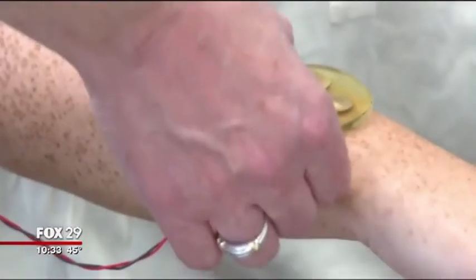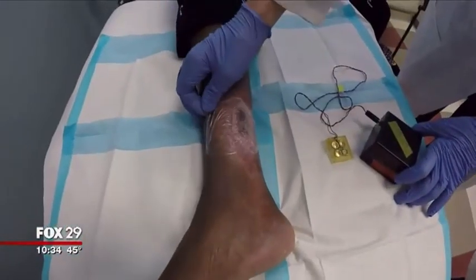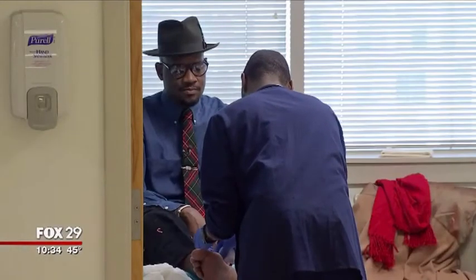"With the funding now, we are going to build a better device than we did in the pilot study. The ultimate goal is to actually build this into a compression stock so the patient will actually wear it and get active therapy at home. We're going to be looking at patients with venous ulcers. We're going to be looking at diabetics. They have to have good circulation, no overwhelming infection. So February, we'll start enrolling our patients."